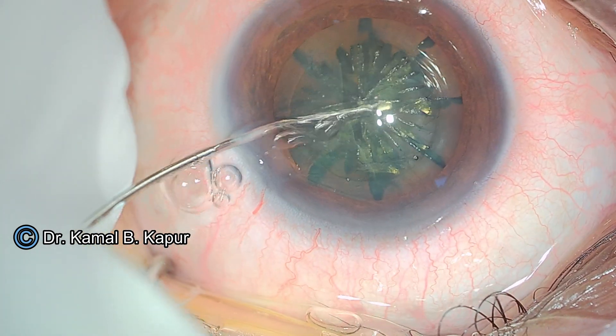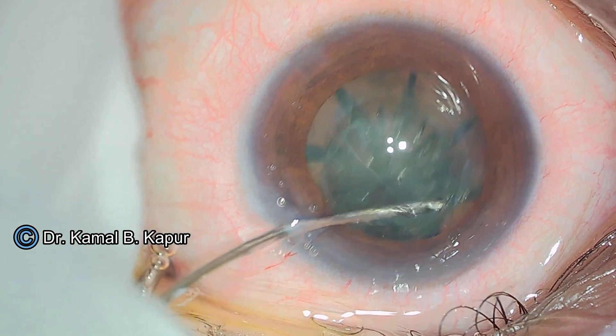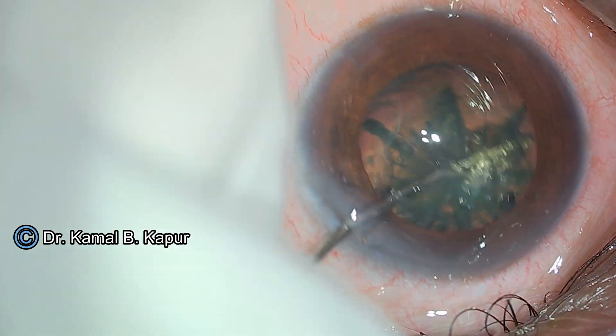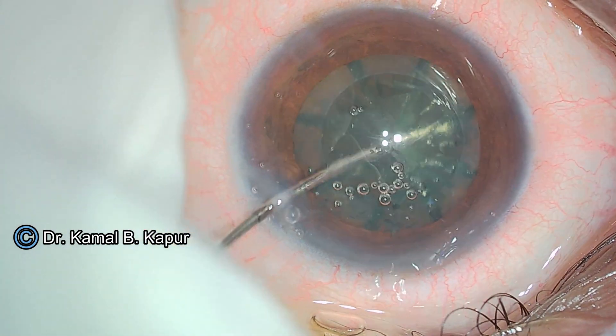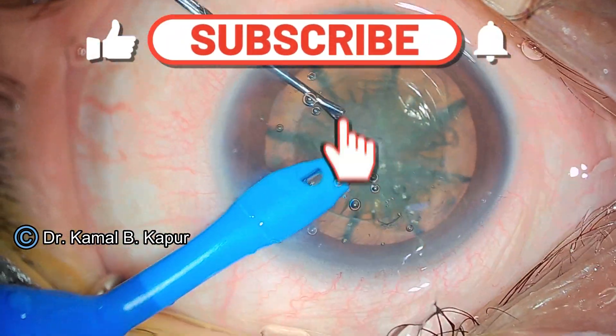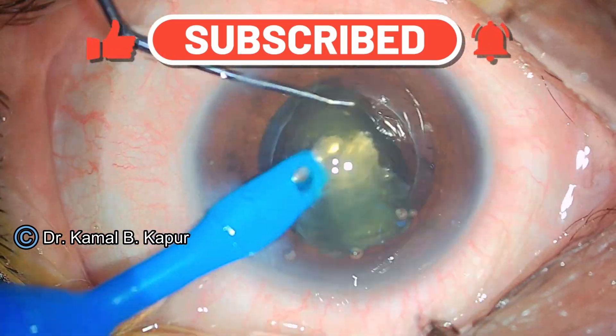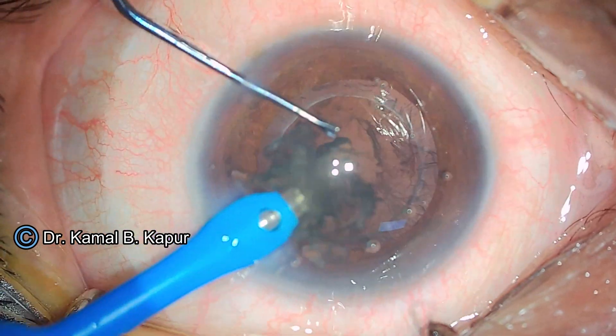In this particular case we perform a cortical cleaving hydrodissection. The nucleus is beautifully raised as we get a fluid wave, and then we ensure a good rotation of a soft sticky cataract. We will fast forward this video for these steps because the intention of this particular video is not to show the femto cataract surgery.